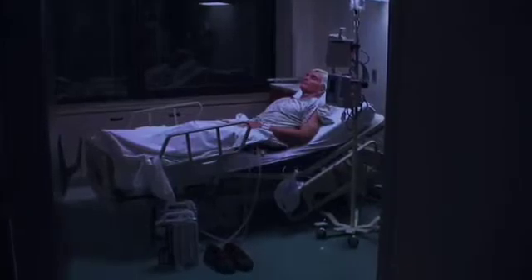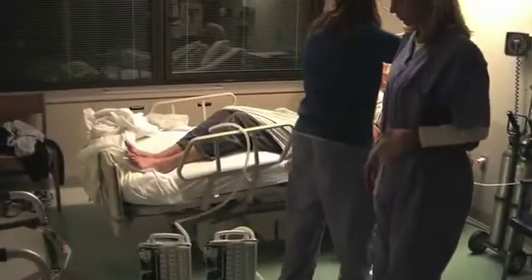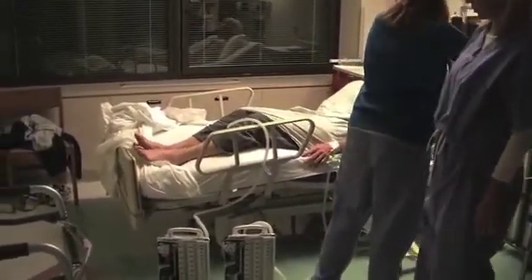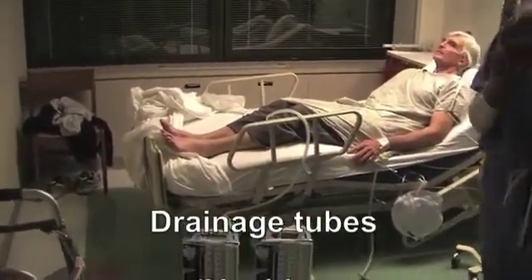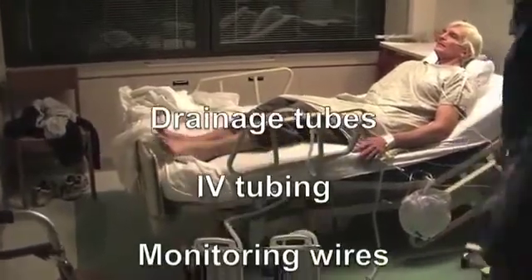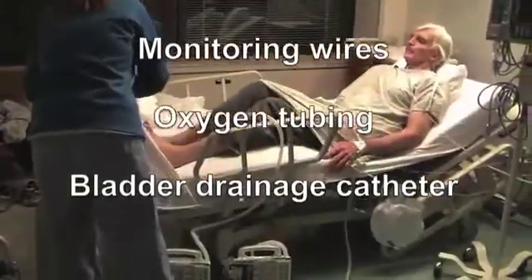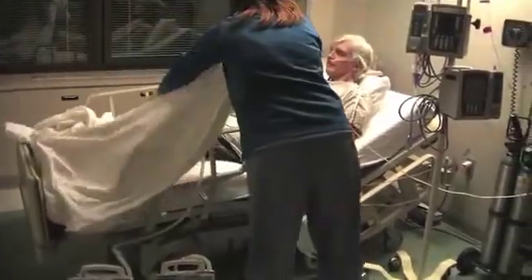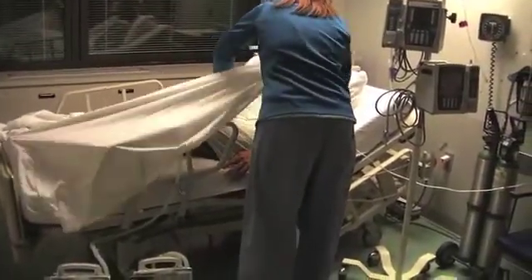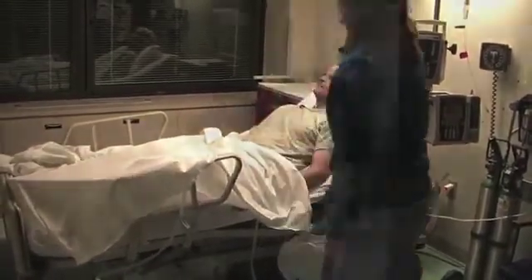Unfortunately, many factors prevent patients from being active: general illness, weakness, fatigue, and pain. In addition, patients usually have impediments that complicate mobilization. These include drainage tubes, intravenous tubes, monitoring equipment, and oxygen tubing. Such encumbrances hamper a patient's ability simply to move about the bed, not to mention transferring to a chair, walking to a bathroom, or ambulating in the hallway. Various devices simply get in the way.